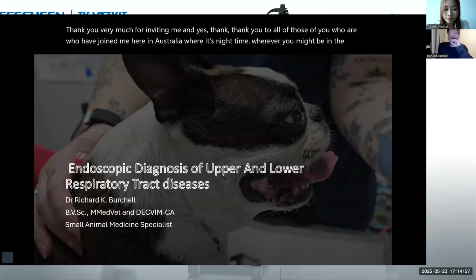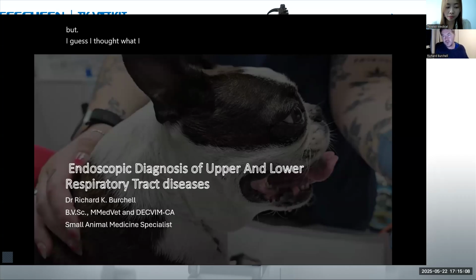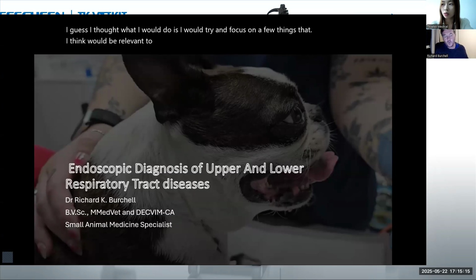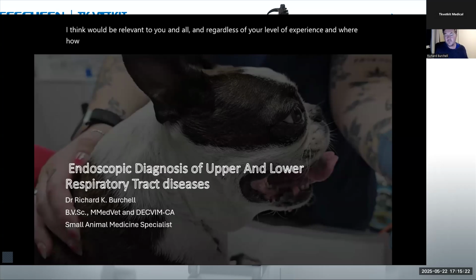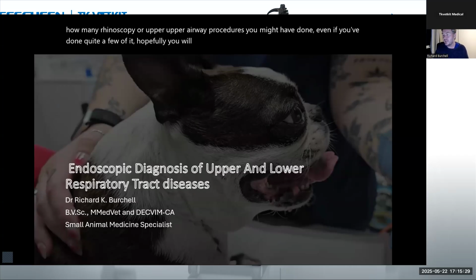This is a very big topic, and I guess quite hard to condense into a 1 hour webinar. But I thought what I would do is try and focus on a few things that I think would be relevant to you, regardless of your level of experience and how many rhinoscopy or upper airway procedures you might have done. Even if you've done quite a few, hopefully you will find this helpful.